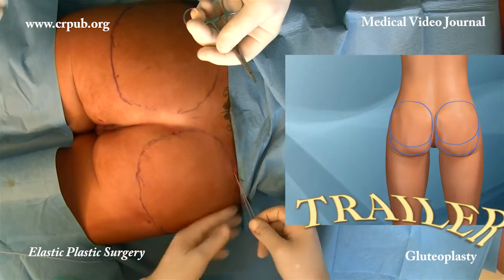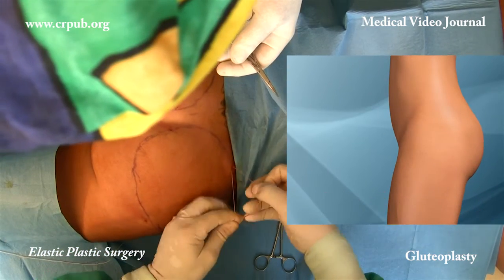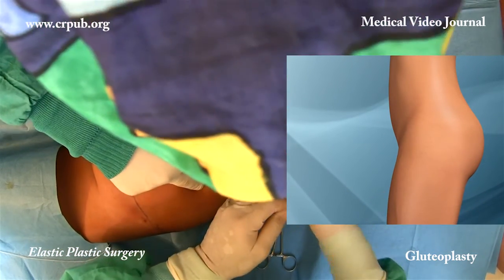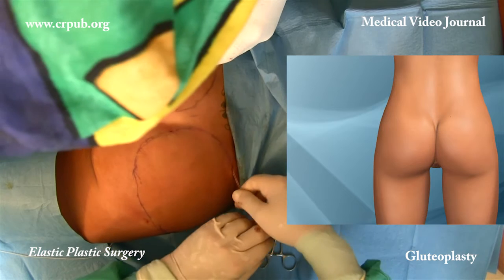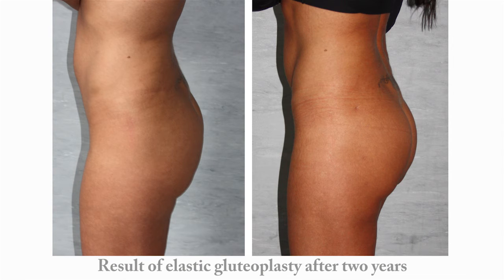Within a few weeks the elastic thread will have been transformed into a natural ligament. The elasticity of the thread, its size, and the fact that it is transformed into a natural ligament will prevent it from cutting into the tissues. This enables a stable, long-lasting result to be achieved.